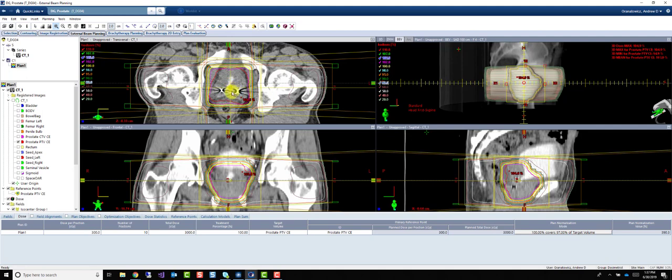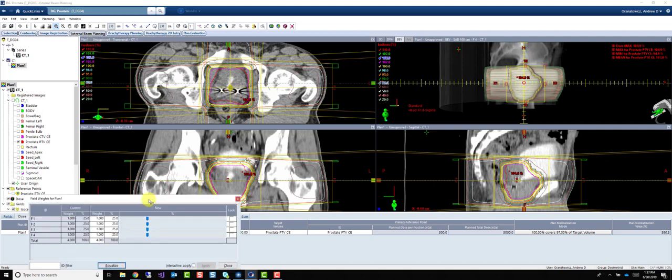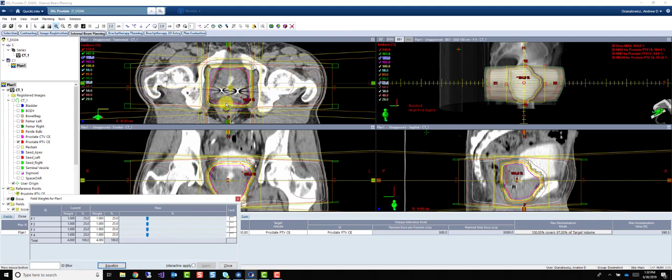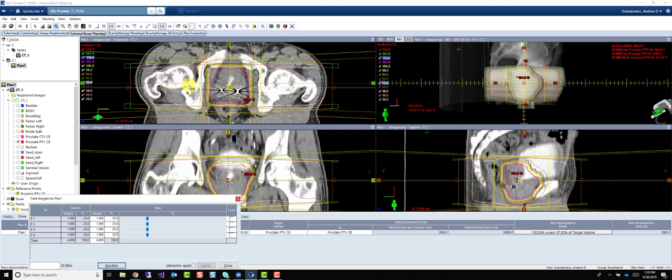What you can do is definitely play with your weighting in order to get the distribution that you want. Maybe you want more coming from your lateral beams in order to spare your rectum and bladder better. Maybe your top priority is rectum, so you would scale your other three beams, your AP and your laterals, more than your PA to get dose out of your rectum. Whatever the case may be, you can certainly do that.